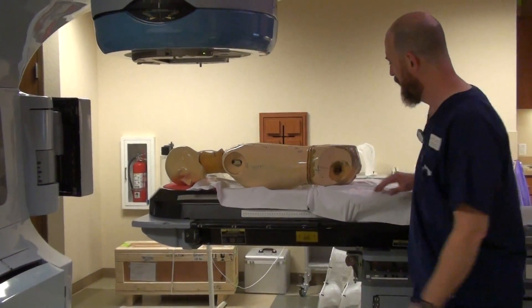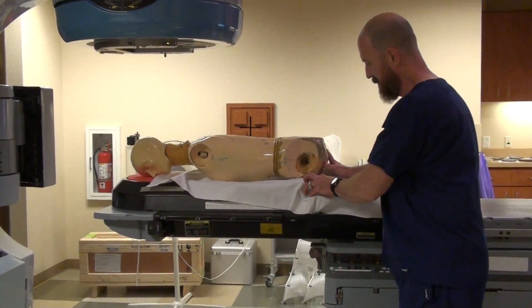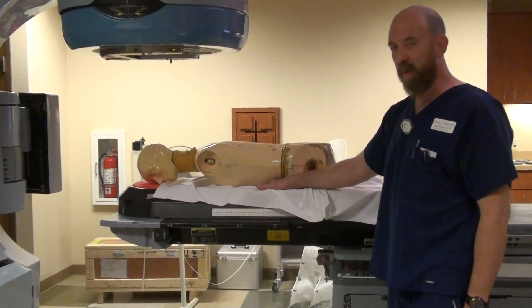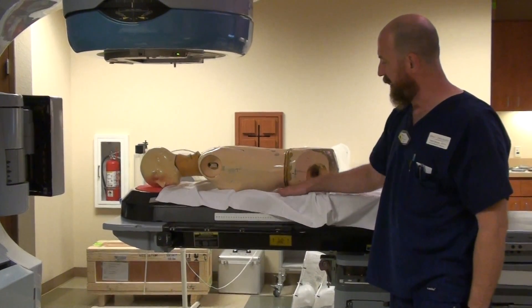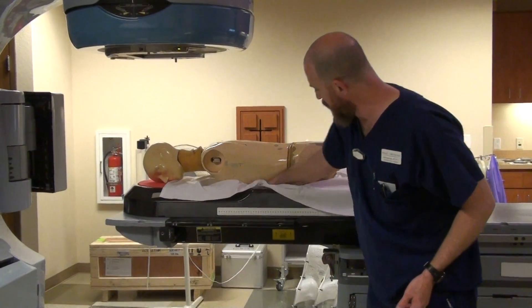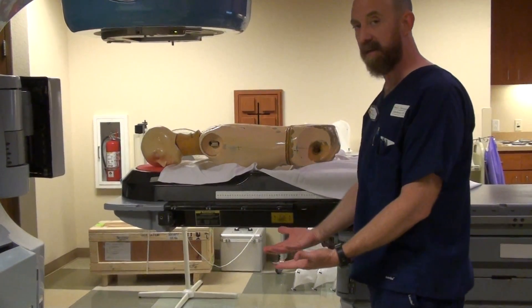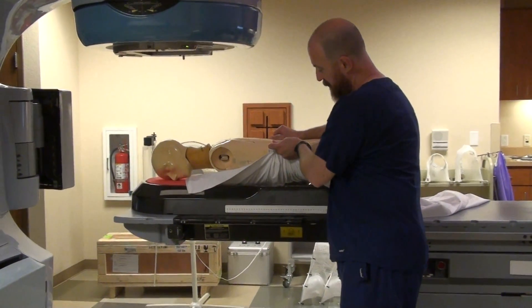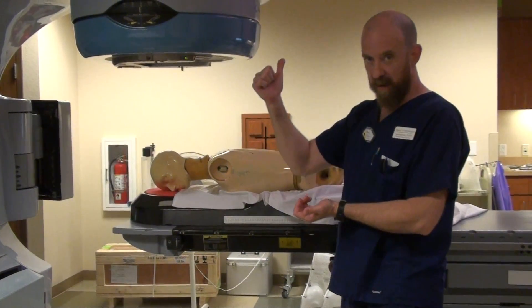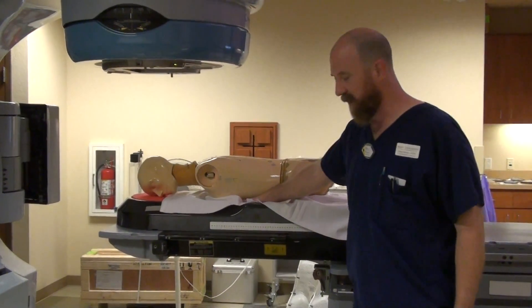Through the magic of television we have a sheet. You want to make sure that the sheet is not pulled tight. If you have the sheet pulled tight, you're going to do away with a lot of the benefit of the belly board itself. If you have the sheet pulled tight holding the belly up, why have the belly board? You want to make sure that the sheet itself pulls down underneath the patient and that the patient's belly hangs free. You don't want to create a hammock that tightens up and holds that soft tissue posteriorly. Make sure that anything you have around the patient is loose and in the hole.